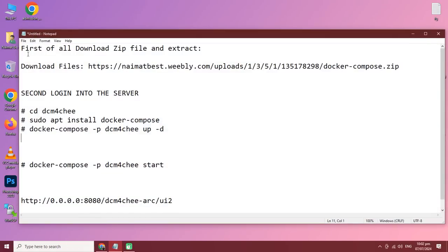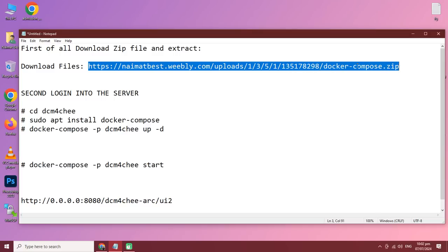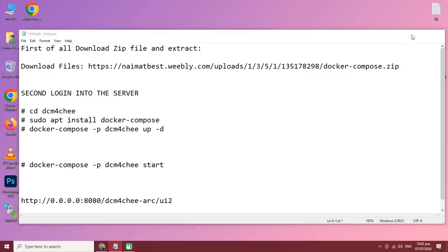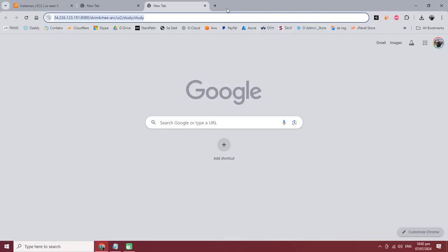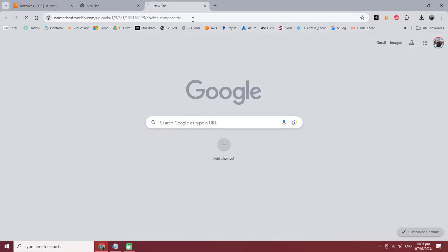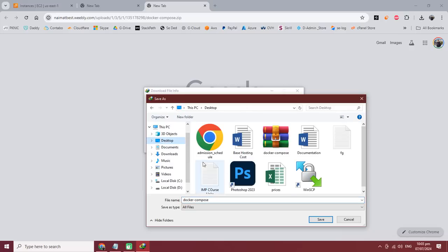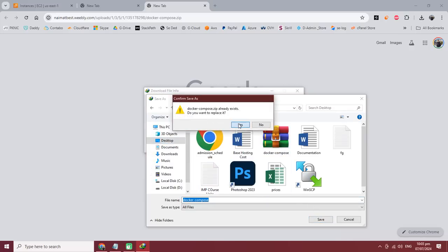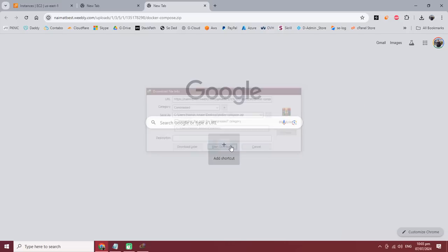First of all, you need to download this zip file. Copy this open link into your browser and download it. I have already downloaded it and it's available on the desktop.